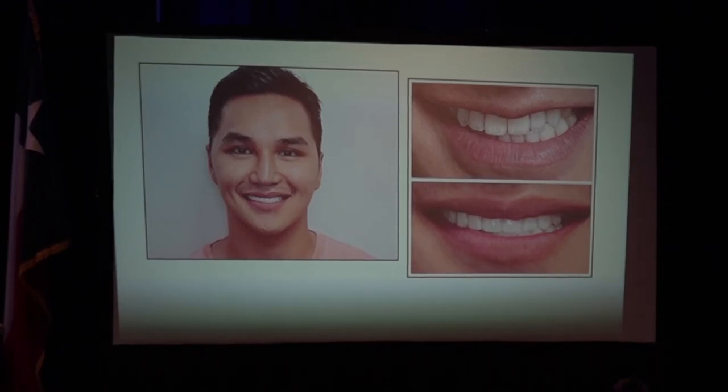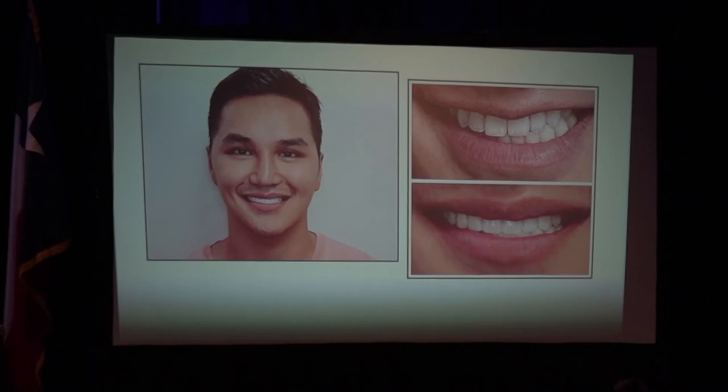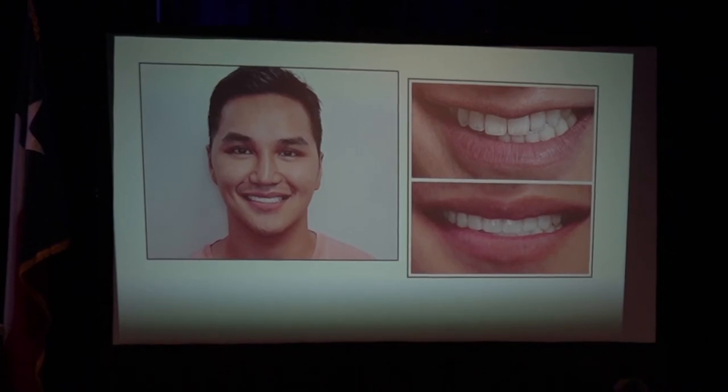That's why I'm saying the digital dentistry just gives us so much power. I've got so many patients that come in, it's always a wedding, and they come in on a Friday. What can you do for me? And so we do that. Sometimes we do the same day. We design it real quick, we 3D print, tell them to come back at 1 o'clock. It's an 8 o'clock appointment. And I've done full mouth cases from 1 to 3, prep them up, scan them up, and they leave with the temps.